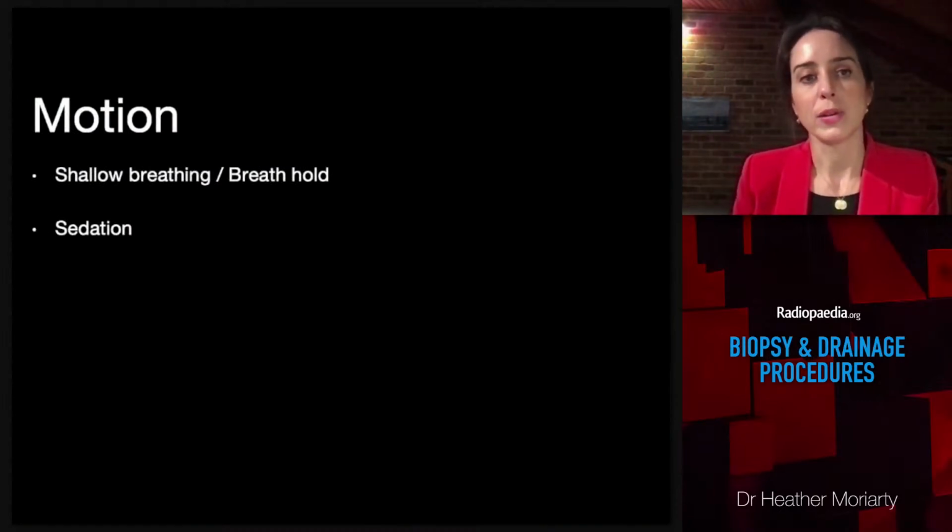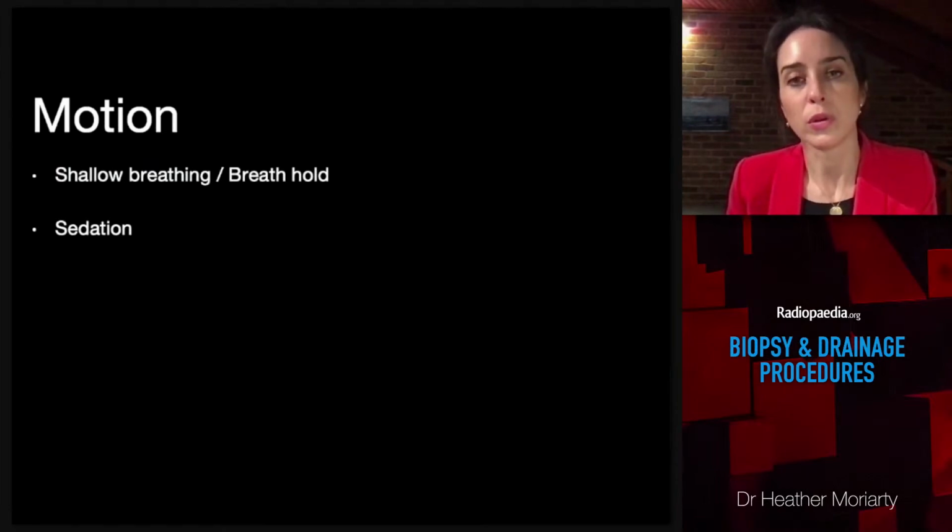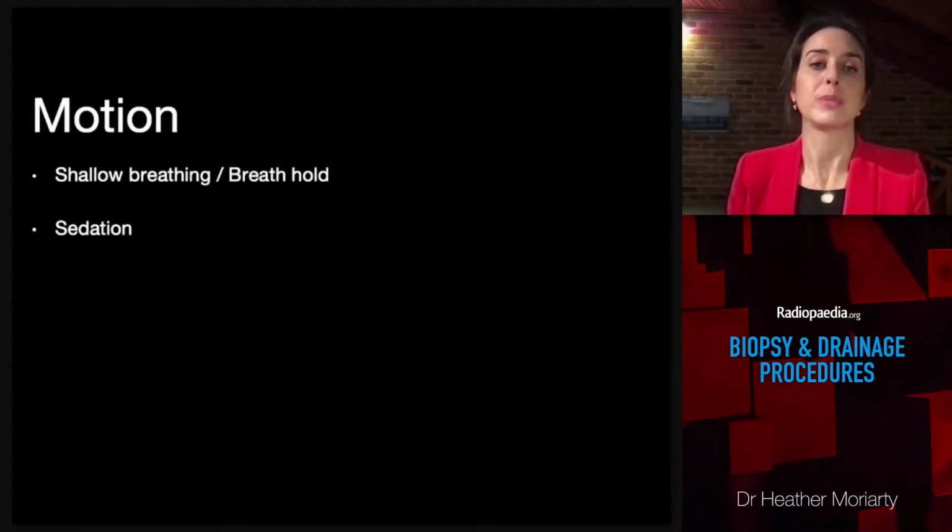Just a word on breath holding. In general, I try and do most procedures with normal or shallow breathing. Explain to the patient not to take really deep breaths in or out, just to try and reduce the variability of breath holds. I do watch the patient's respiration and time my movements based on that.